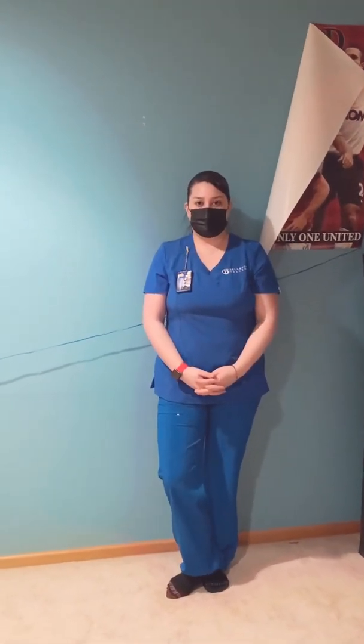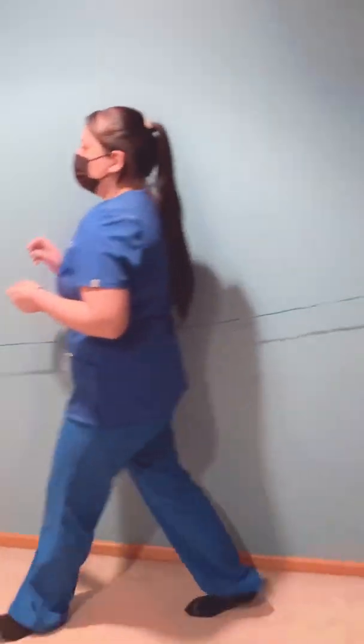So today I've been assigned to a patient who has a UTI, and I'm going to be following the following procedures: an IV push, a primary IV bag, and a secondary IV piggyback. I have gathered all of my supplies, and I'm going to be performing all three procedures at bedside. I'm going to walk to the patient's room.